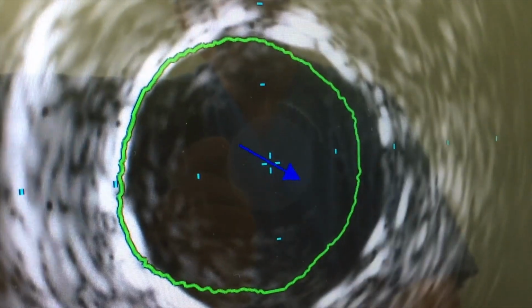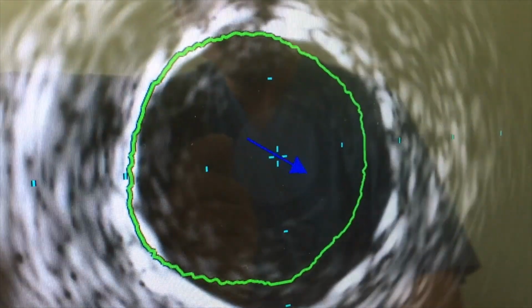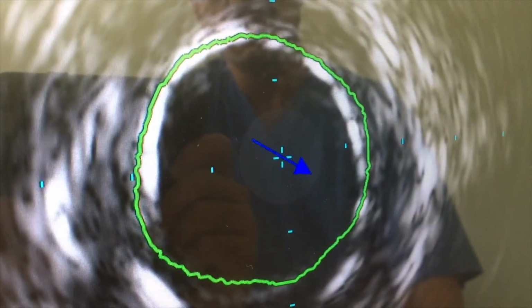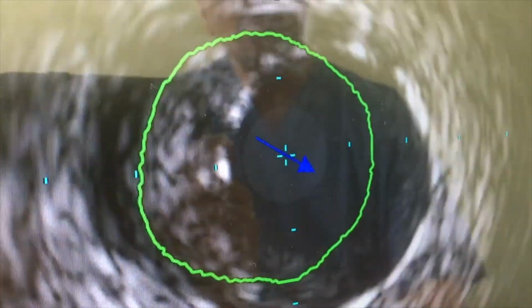So this is better expansion. This is even better than what we've drawn. So this way you can compare the stent expansion all over by just putting this lock sign on and drawing the cross section of the stent and then comparing it with the remaining stent. So this was just to show you how it looks.